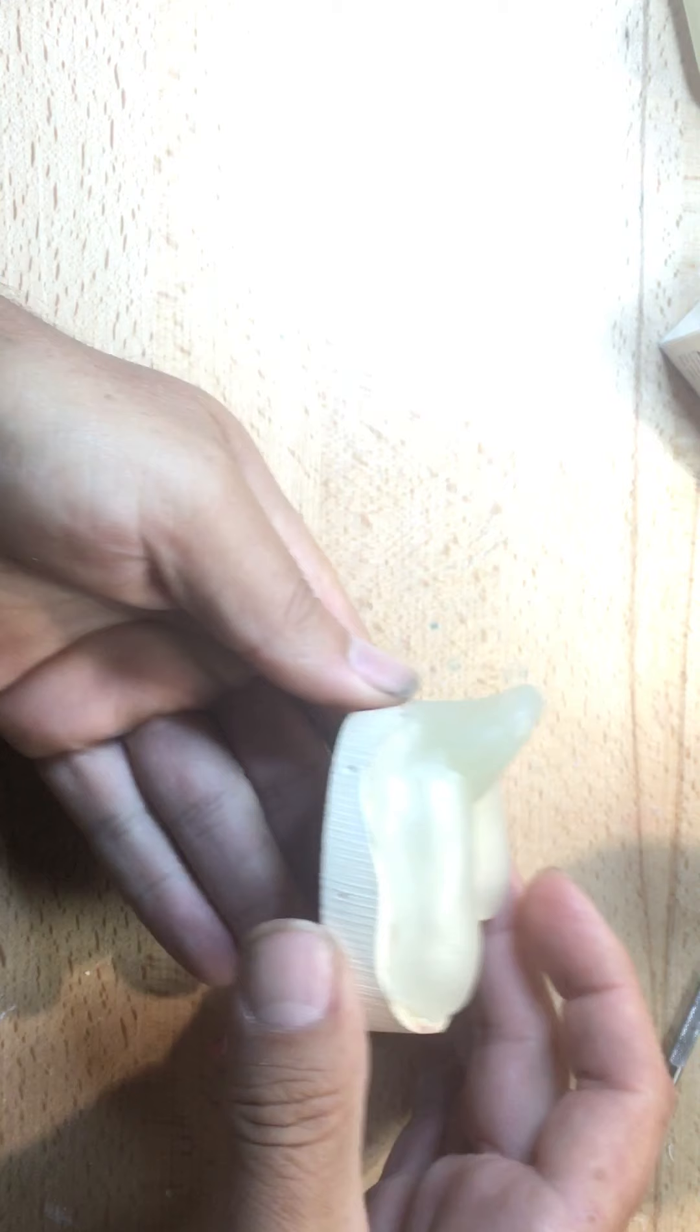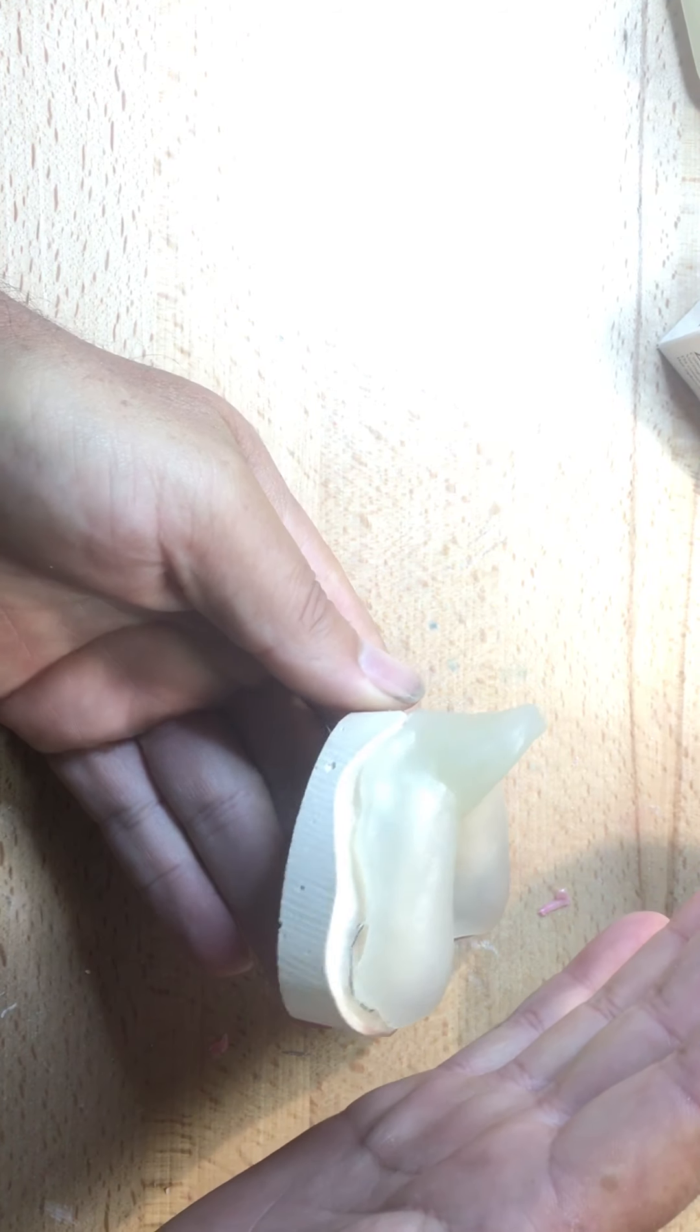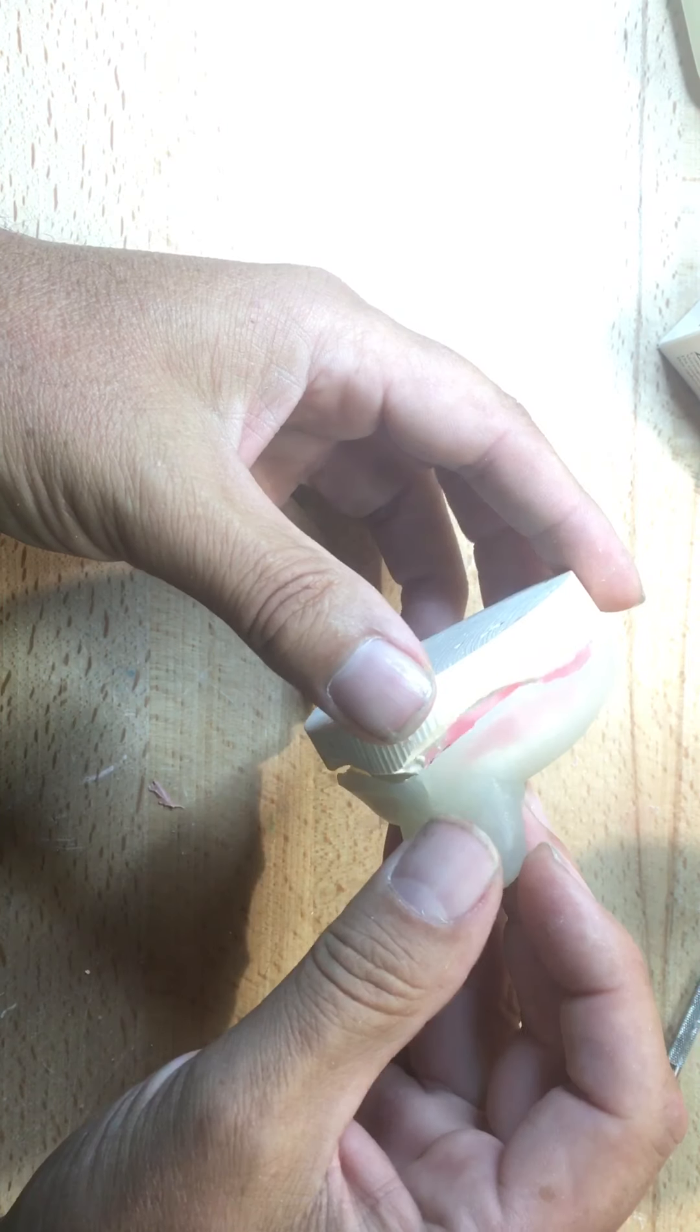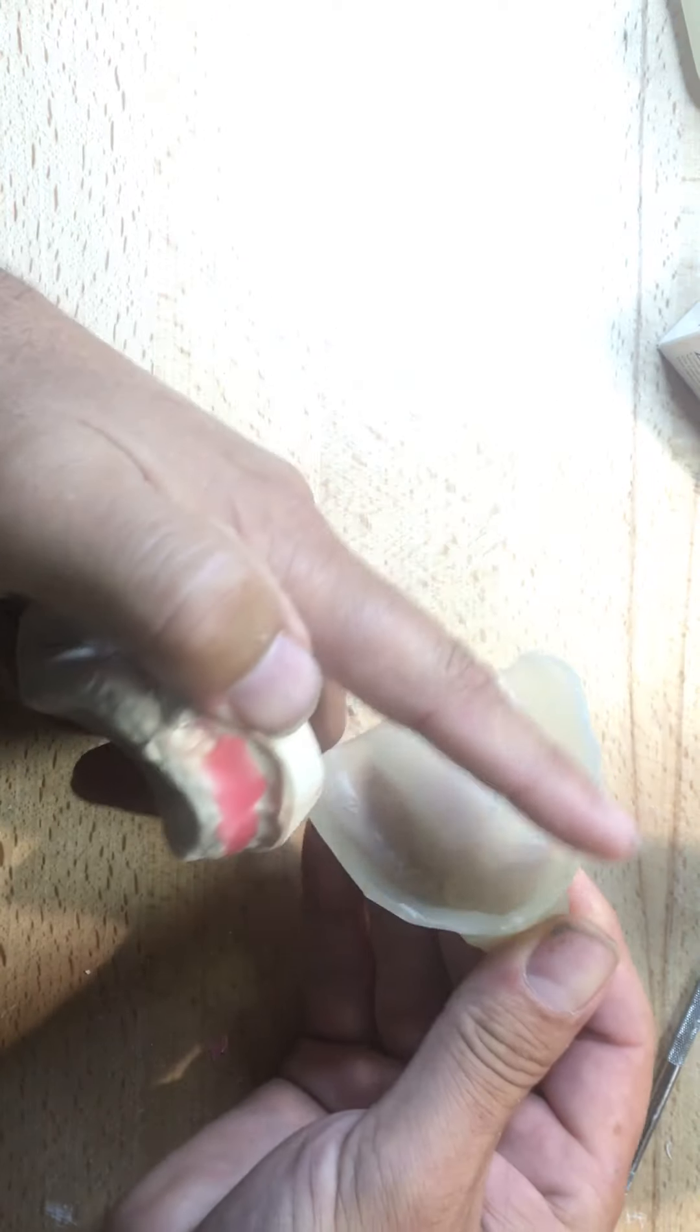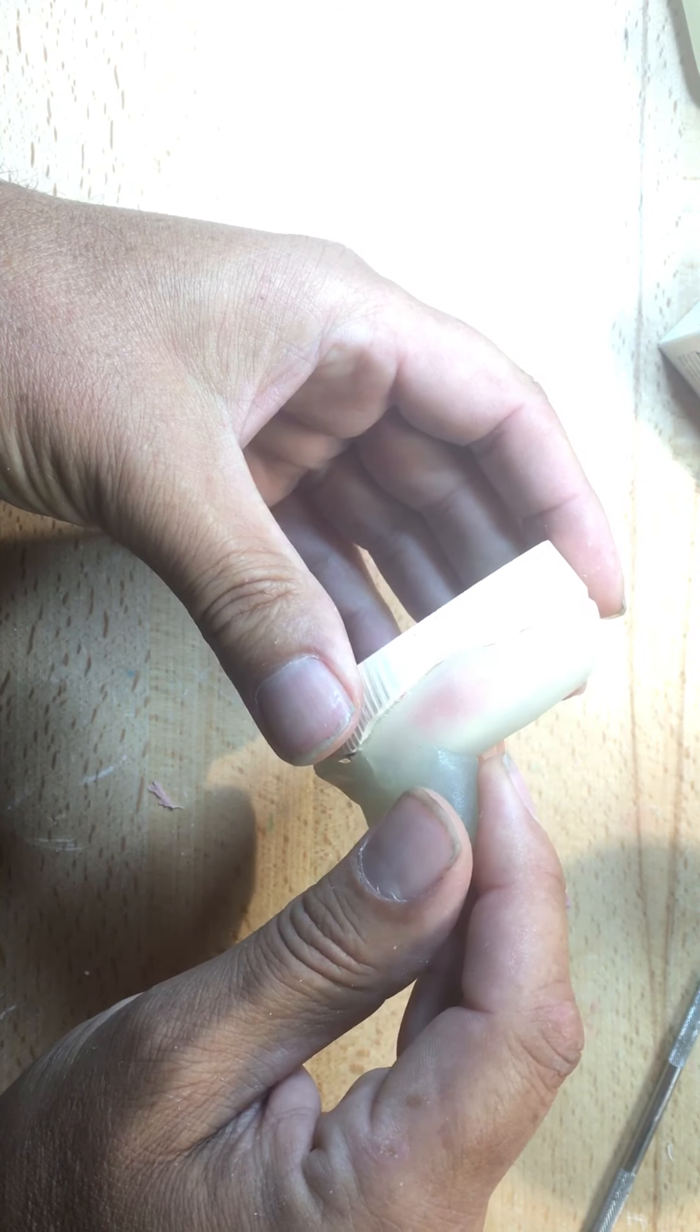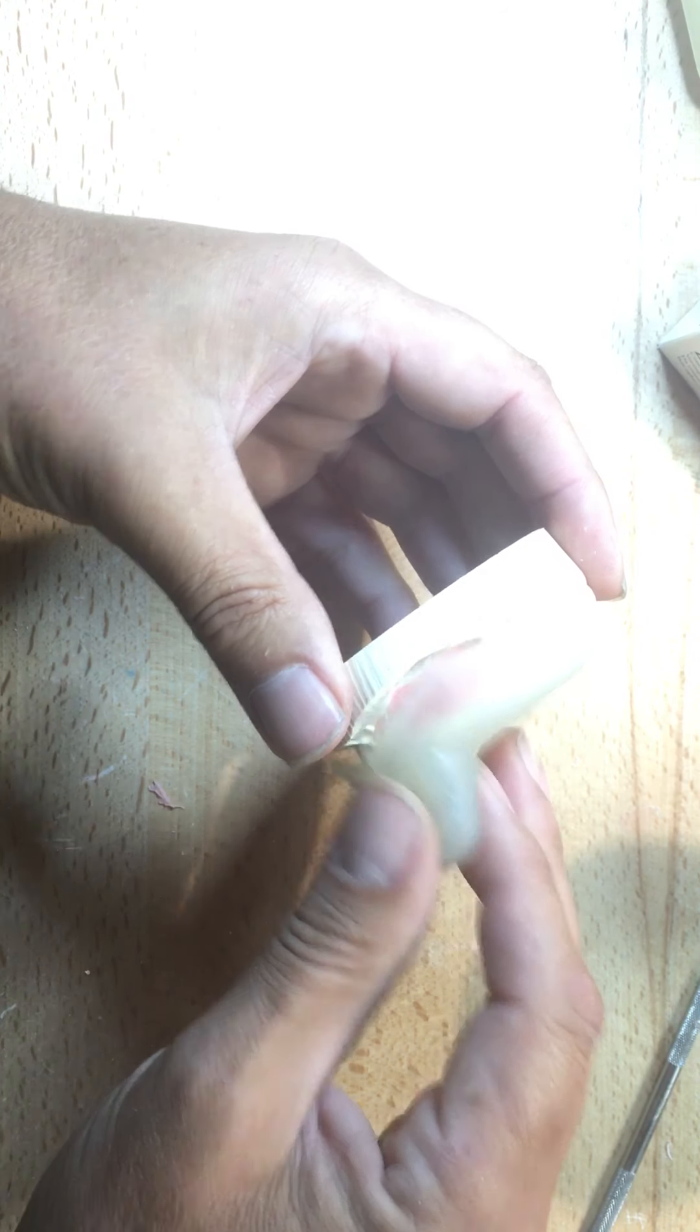So here's my custom tray. You can see my handle. It's slightly angled forward, but not much 10 degrees, 15 degrees. You can see that I'm overextended. I'm going to go over on the lathe and the handpiece. I'm going to round the edges, cut out the frenums and, well, I guess we can't, we'll do that real time.